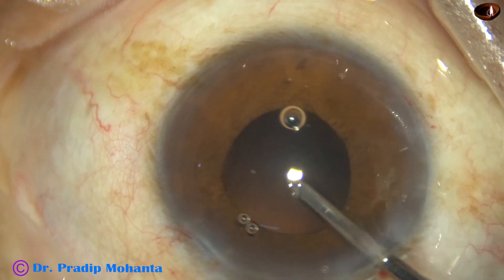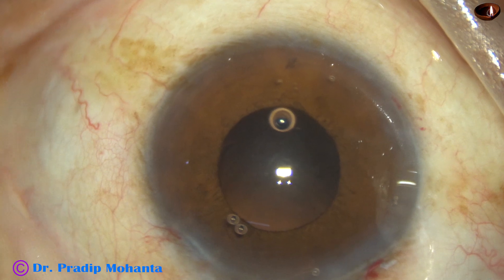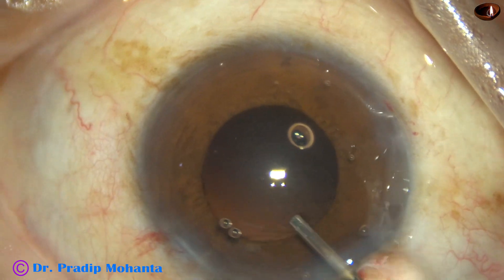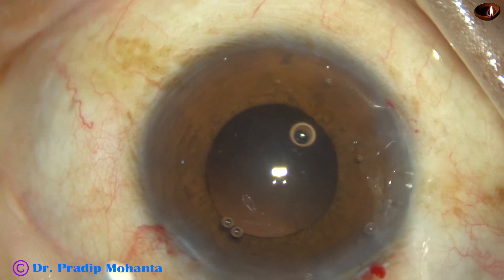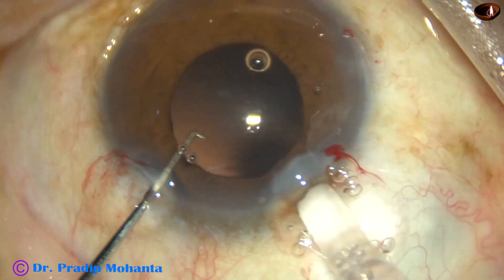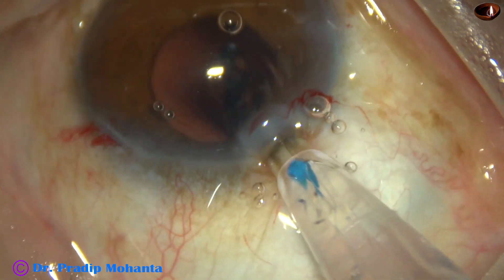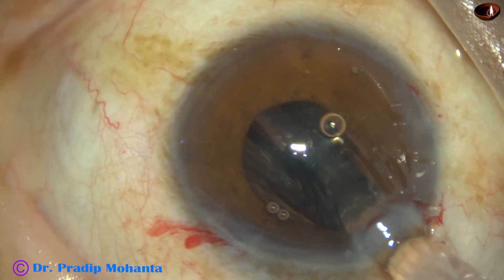In this case, we have selected a Hoya single-piece monofocal intraocular lens. Viscoelastic is used to fill the bag as well as the anterior chamber. Now the cartridge goes into the anterior chamber.